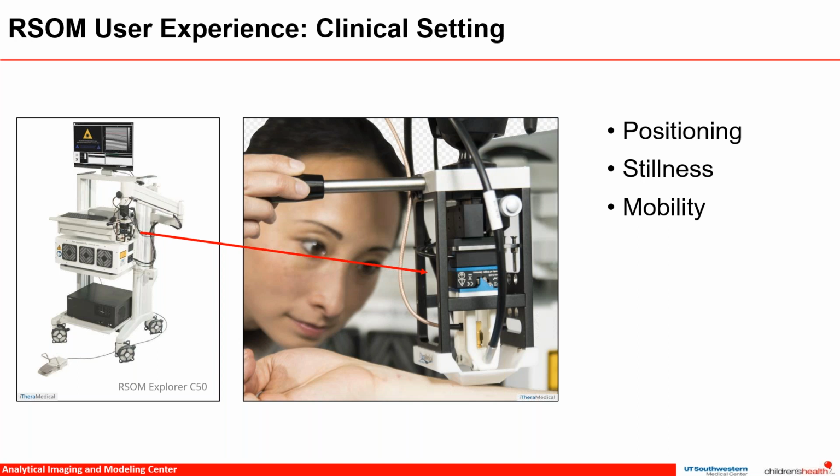In addition, the patient must be completely still for the 2-minute duration of the scan. This is easier when the patient is under general anesthesia, but it can be difficult if performing the scan on an awake individual, such as when we did the scans on the legs of adults with telangiectasias. Luckily, there are ways to adjust for motion in post-processing, but stillness is still required for quality scans.